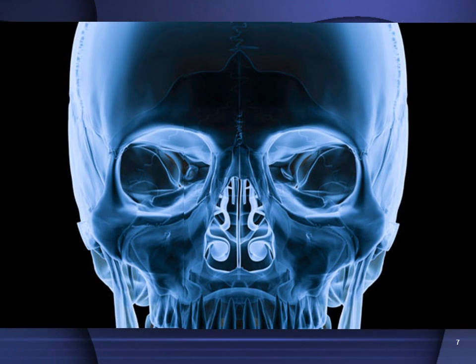This is an example of a 3D reconstruction using CT technology of a patient's skull. And in this image, this is very interesting. We have an ultrasound, a Doppler ultrasound, combined with a CT scan of the patient. And the specific area of the body is the abdominal aorta. Okay? And it's been color enhanced, and it's nice that they've labeled the various arteries here for us coming off the abdominal aorta.